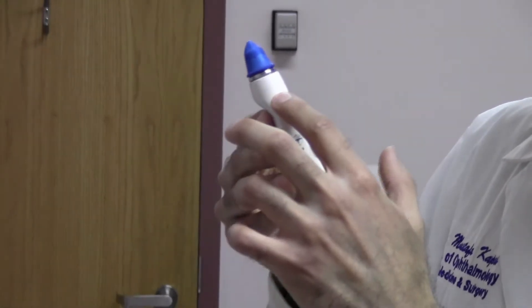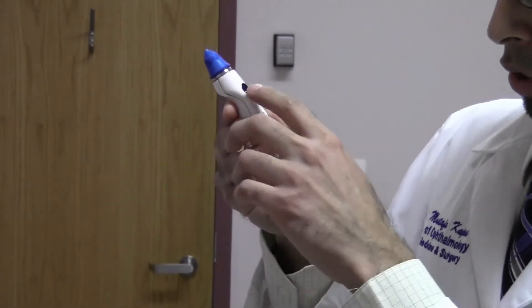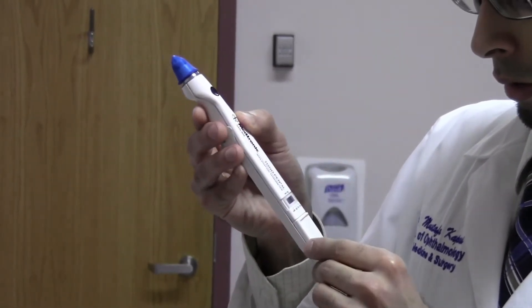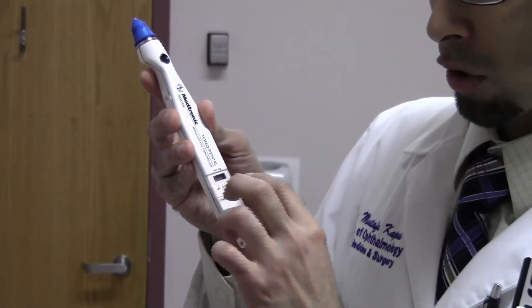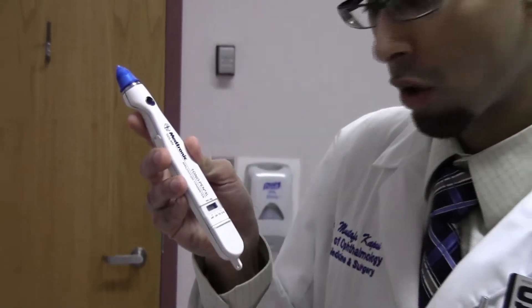How it works: press the black button at the top. The tonopen will now turn on. There will be two lines of dashes on the display. When there are two lines, that means it's ready to measure the pressure.